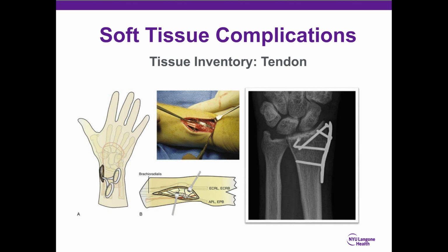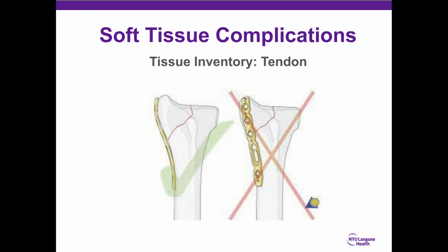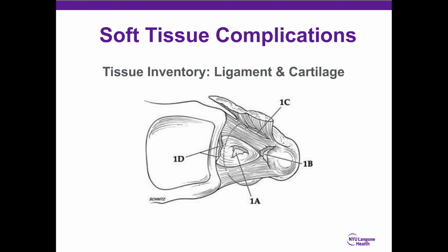Some think that maybe some of the larger radial styloid type fractures can be buttressed that way. I just always had a little bit of trepidation, but now that we can largely control some of the radial styloid fractures through volar plating, I feel a little bit better about that. But even when they look really good radiographically, these are still relatively bulky and obviously in great intimacy with the moving structures of the first dorsal compartment. This was just the admonition about their placement, really watching out not to bring it around to volar, actually.